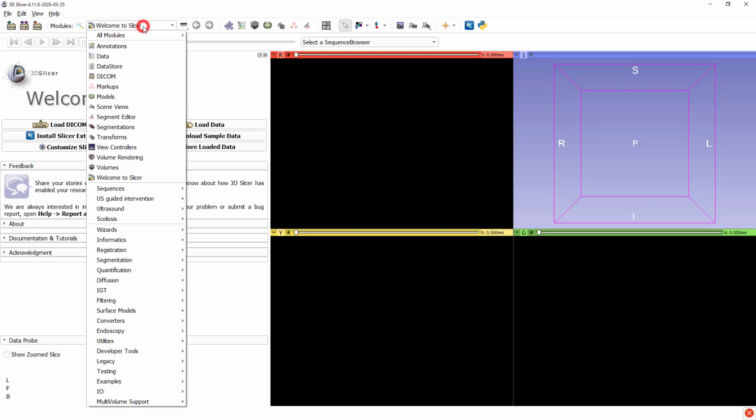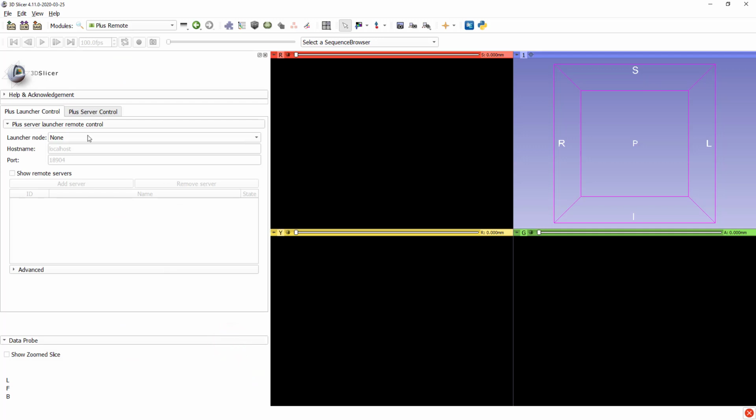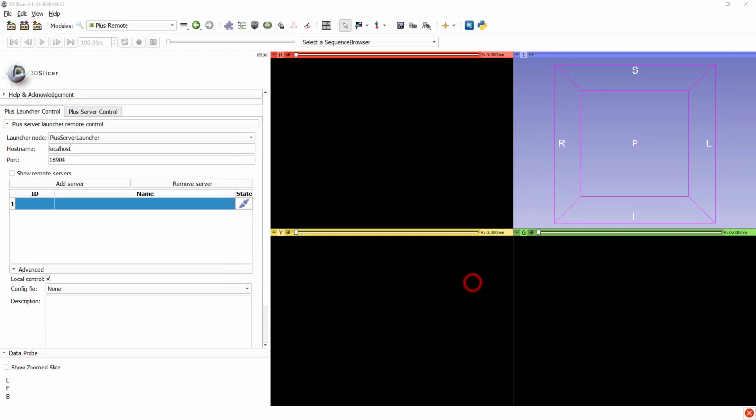We are going to have a look at the new live function of the volume reconstruction module. The new way of using Plus is to use it from the Plus remote. We can create a new Plus server launcher and add the Plus server. The config file for Plus can be opened in Slicer as a text node.